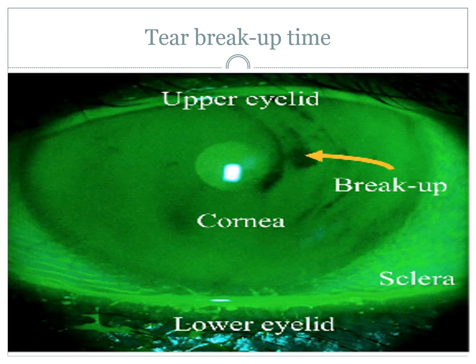You first off put Fluorescein into the lower fornix of the eye, so in the lower part of the eye, and the eye is examined under low magnification. So you don't have to zoom in, you want to see the whole eye itself, and you must have a cobalt blue filter. Once the Fluorescein is in, the patient is asked to blink once and then keep the eyes open for at least 10 seconds.